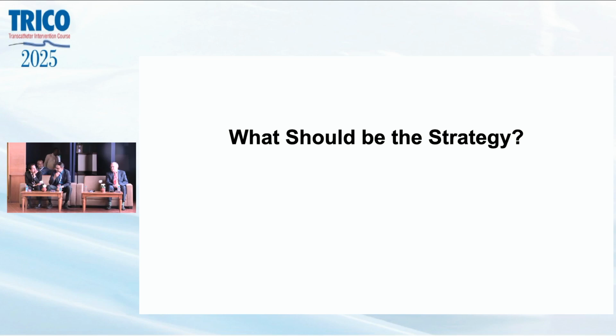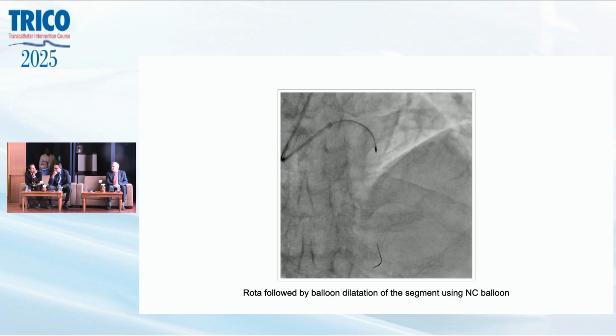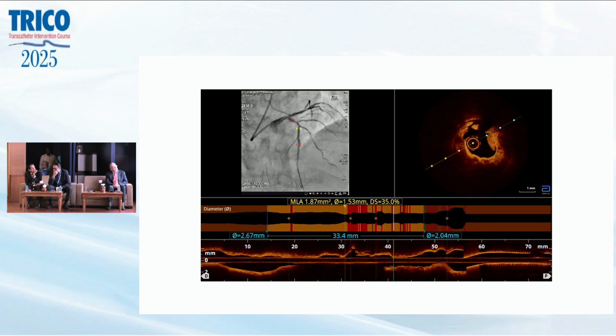Here, I did rota and dilated, and then the OCT picture was taken. The case was to be finished in 35 minutes. See the problems.